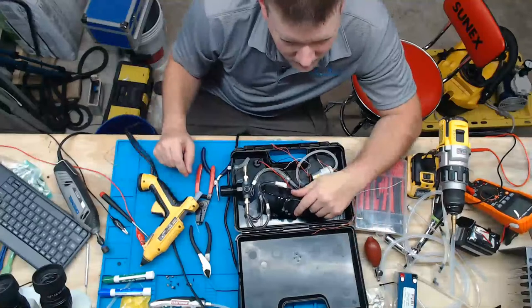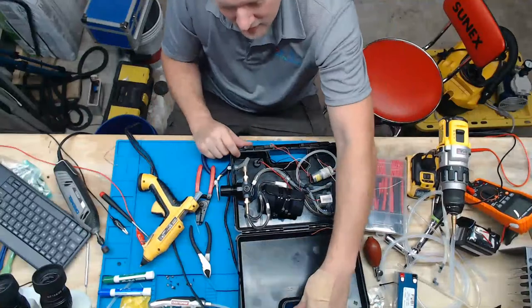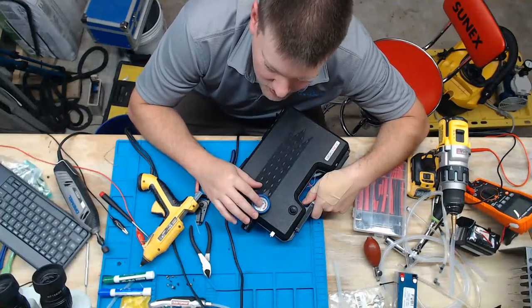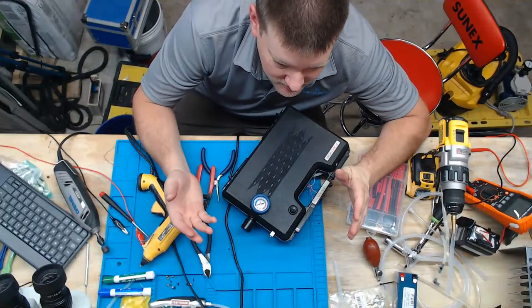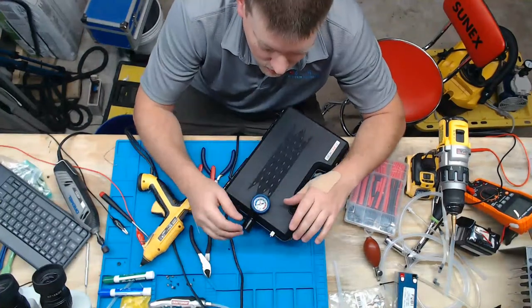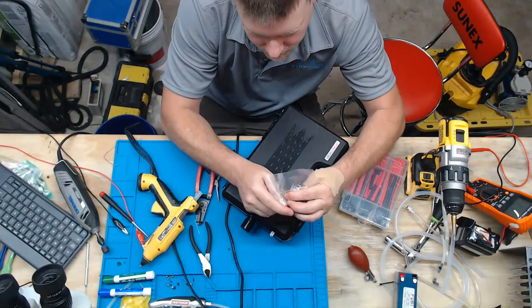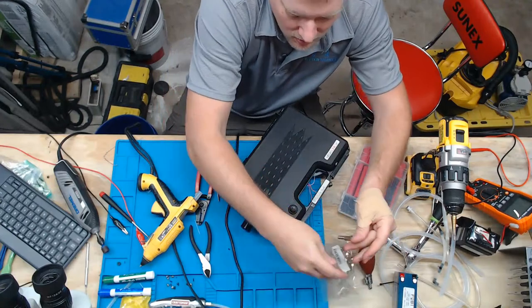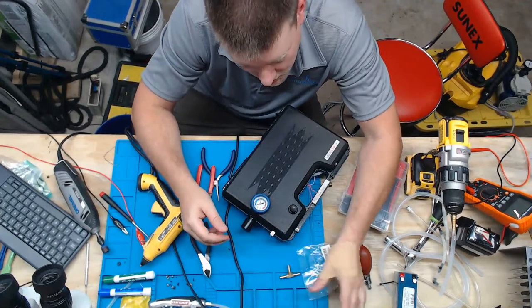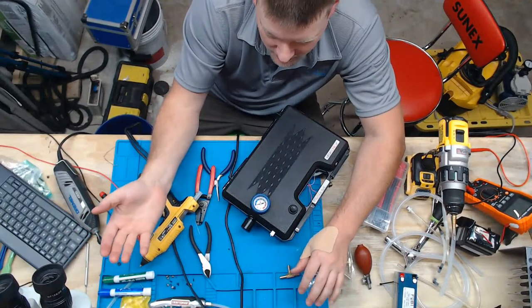And then you hit the button on your medical device and say, hey, I'm at 250. So, the analog gauge right here, this is just for reference, okay? Just to show you where you're at on the scale. Really, what's going to be teed into here, and I have a whole bunch of these brass tees, is probably your manometer, an electronic manometer, and then your device under test, your medical device.